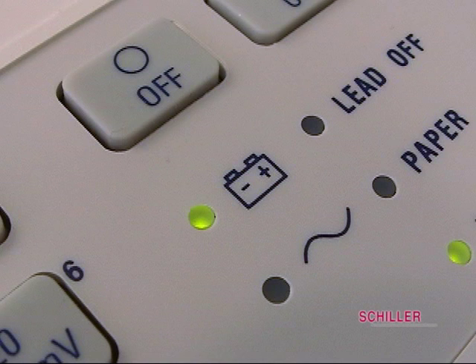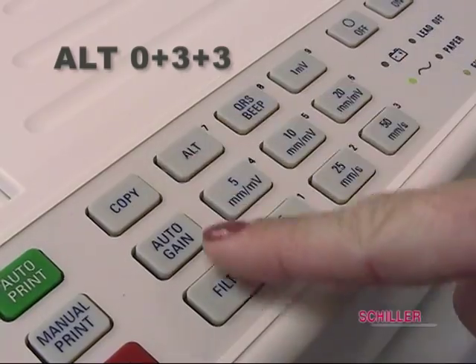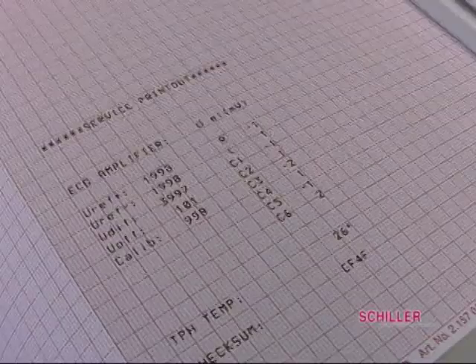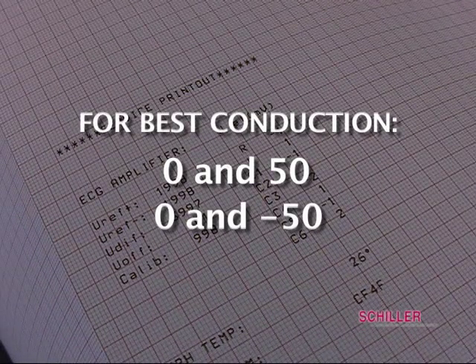The battery icon indicates the battery is charging if low, or working on battery power. The electrode lead-off indicator indicates a lead has fallen off. If so, go to ALT 0, 3, 3 to see conductivity of each lead. The reading should be between 0 and 50, or between 0 and negative 50, for best conduction.